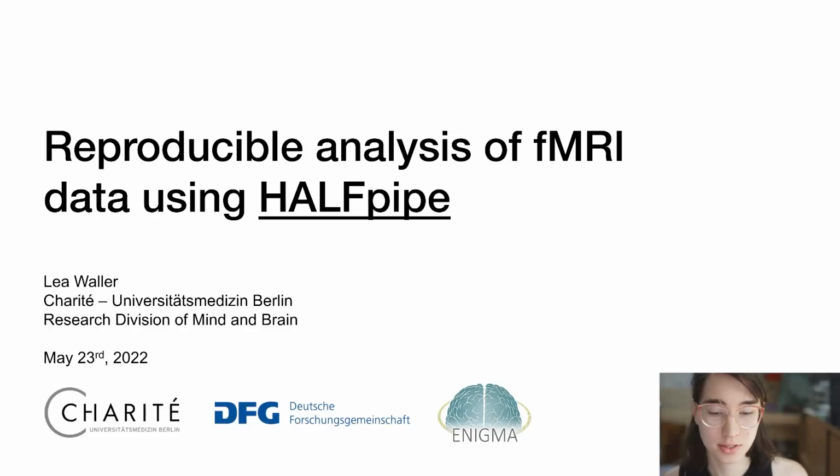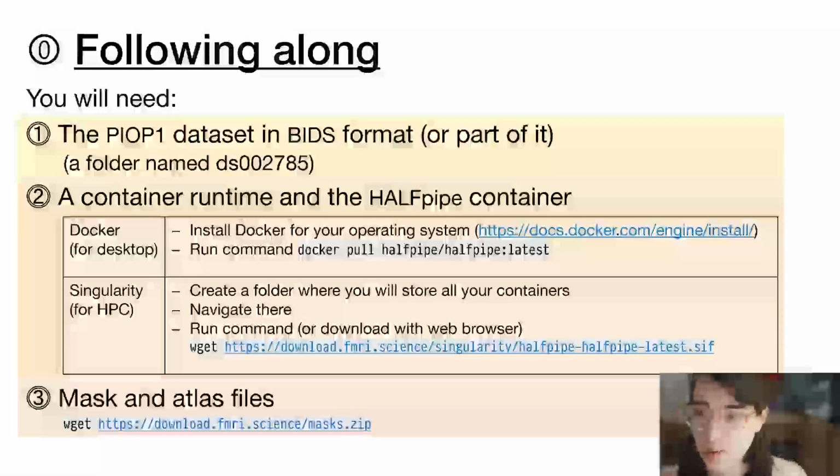and welcome to this session on reproducible analysis of fMRI data using HALFpipe. So my name is Lea Waller. I'm a graduate student here at Charité, and I've been working together with the awesome team here on this pipeline called HALFpipe for the past few years, and so I want to give you a brief overview of it.